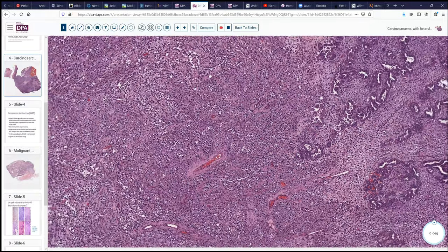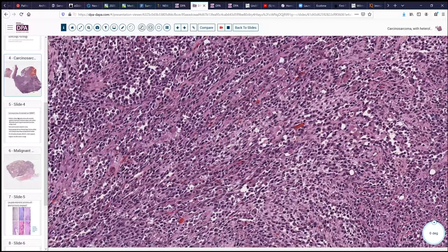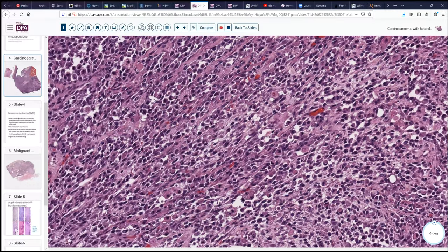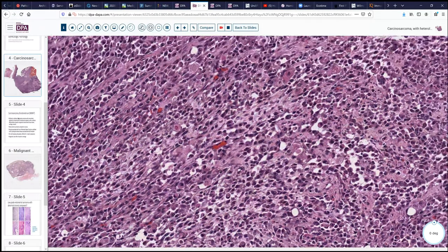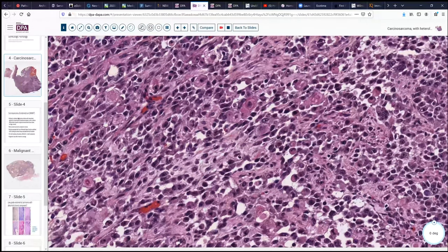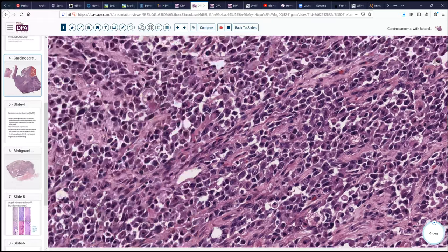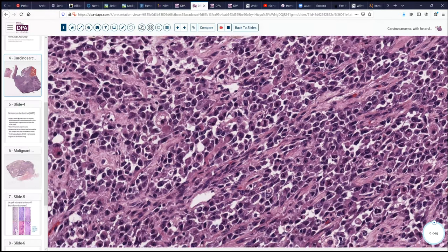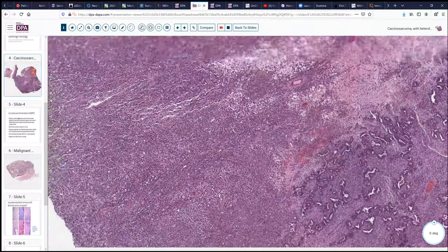We'll look at another area because this tumor has quite a number of different morphologies. As we look through these areas, one of the things we're scouting for is: do we have heterologous elements? Do we have any evidence of skeletal muscle differentiation? Do we have evidence of cartilage or bone? Sometimes the thing that will tip us off is clusters of cells with very eosinophilic cytoplasm, inclusions within the cytoplasm — some evidence that there may be abortive striated muscle development trying to happen here. There's some evidence here of abortive skeletal muscle differentiation.